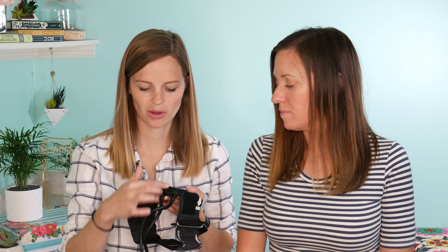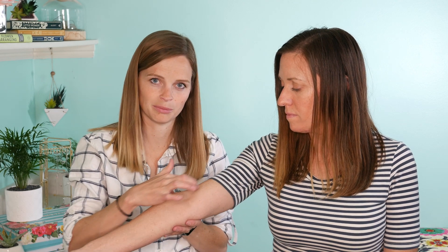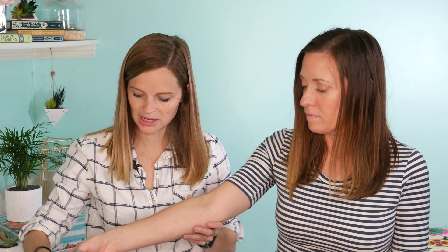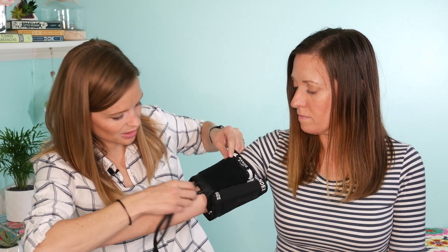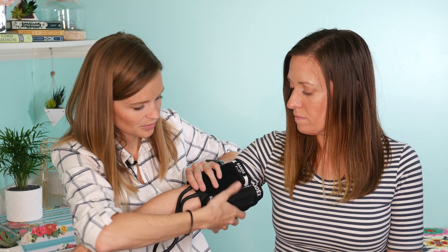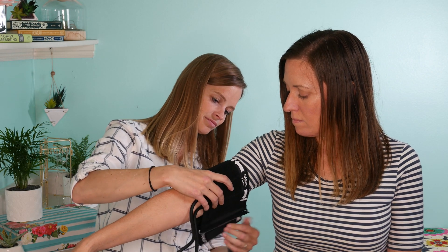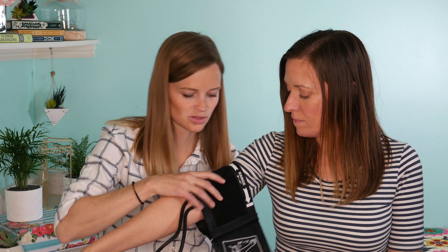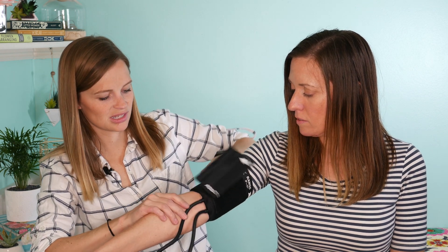The cuffs will usually say on them where to position it, but if it doesn't, right about where the tubes are connected is where you want their artery to go. So right here on her arm is about where I want that to be, so I'll slip her arm through here and put it right here, then tighten the cuff. This one is just a velcro one, so you want it to be snug to start with.